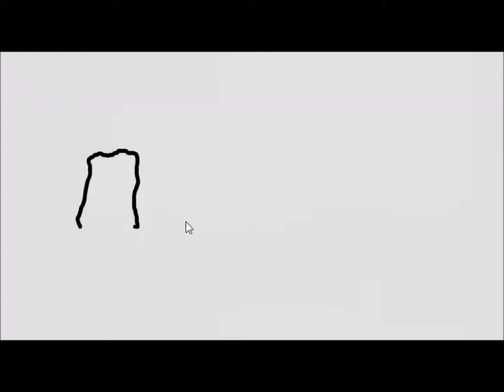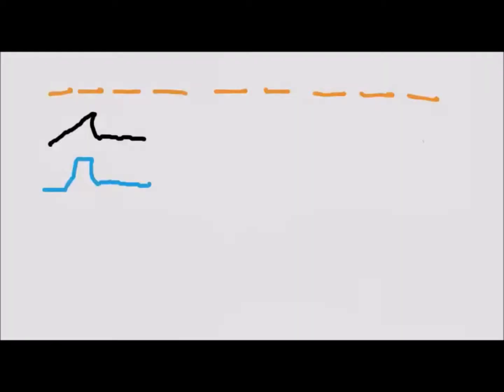If the patient's flow rate is low, I might have a small waveform, and if the patient has a larger inspiratory demand, they have a higher inspiratory flow rate. So this is variable based on the mechanics of the lung and the patient's inspiratory effort. Now I'm going to try to make my argument and explain where I disagree with the authors on how volume controlled CMV with dual targeting provides unrestricted inspiratory flow.